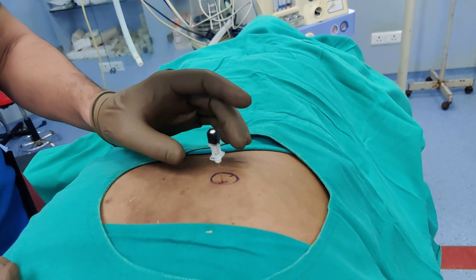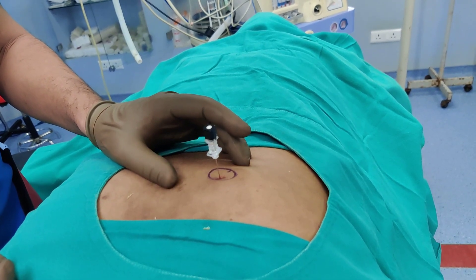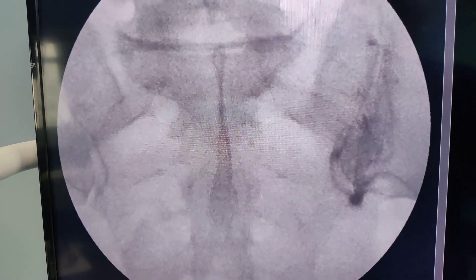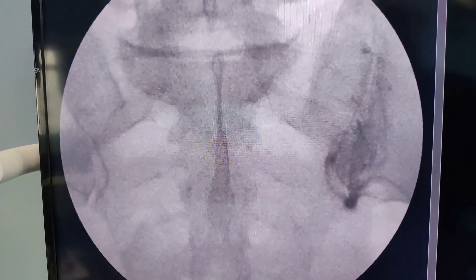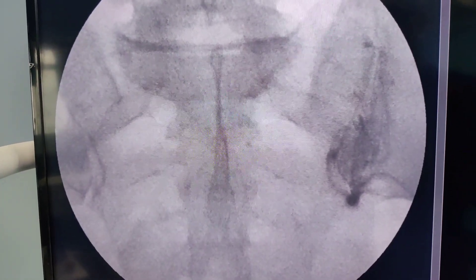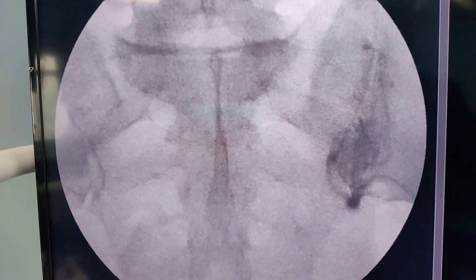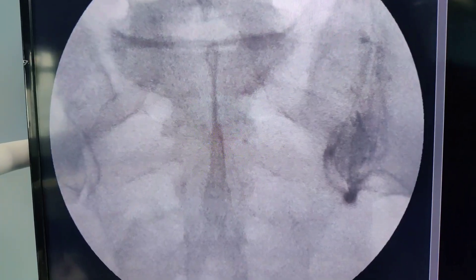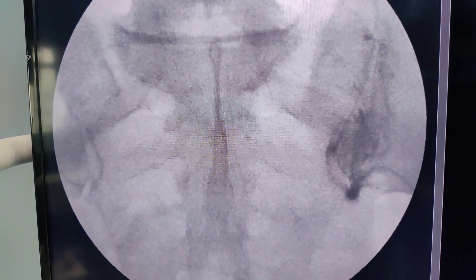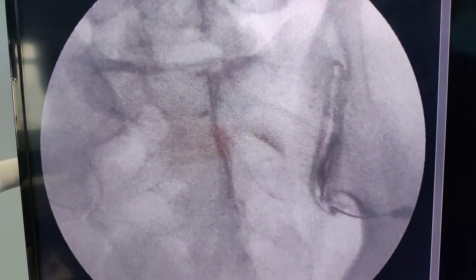My next step is to put some Omnipaque dye in and confirm the position. Looking at the zero degree view, it may look as if the dye is not in the joint, but this gives me confidence it is in the joint. I am now going to take a 15 degree tilted view to confirm.